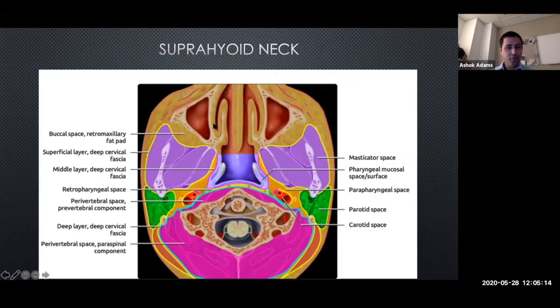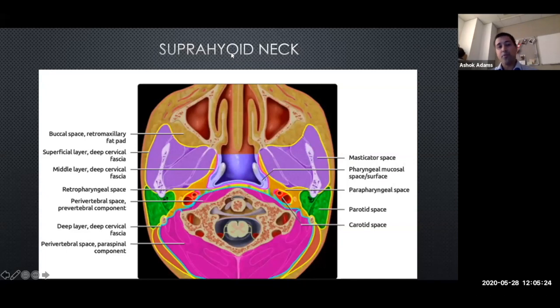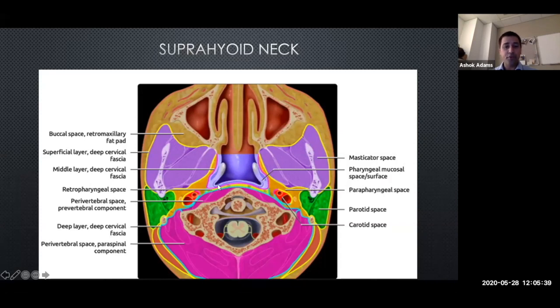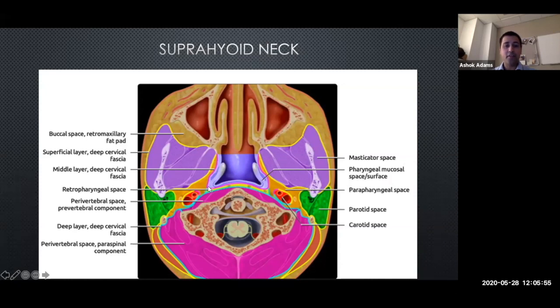Now that we've introduced the fascial layers, we can further subdivide the neck into suprahyoid and infrahyoid. In the suprahyoid neck there are lots of different compartments. Starting from the middle outwards - this is what radiologists call the pharyngeal mucosal space, the light blue area at the level of the nasopharynx, including the torus tubarius, the opening of the eustachian tube, and the pharyngeal recess. The middle layer of cervical fascia envelops all of this pharyngeal mucosal space.